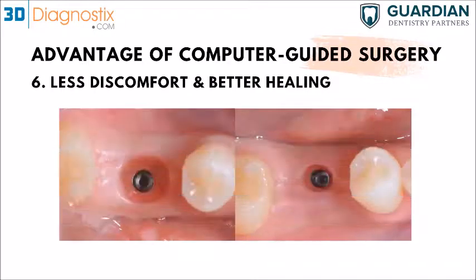And then it's less discomfort, as mentioned. It's better healing for the patient. Here's a picture of the tissue healing well in a flapless procedure. You can place a healing cap on top of that implant and end up having a good emergence or good tissue profile.